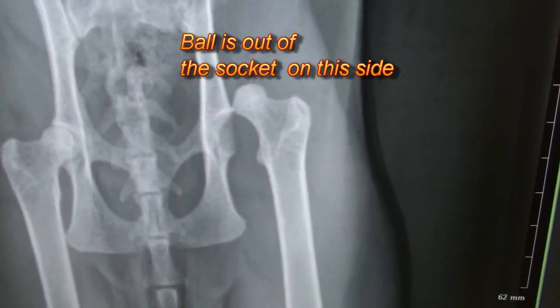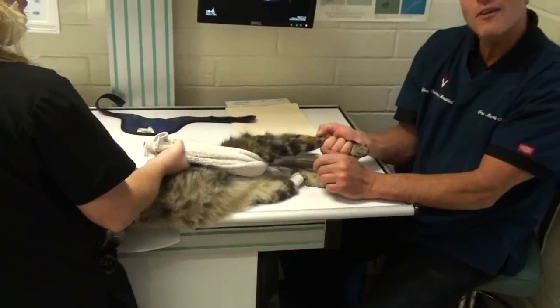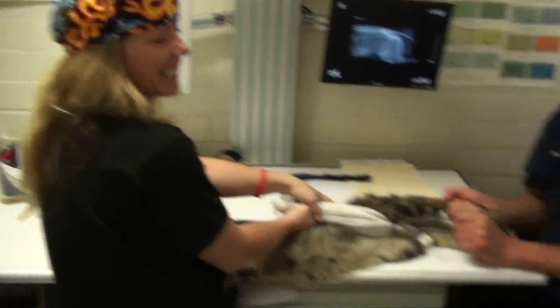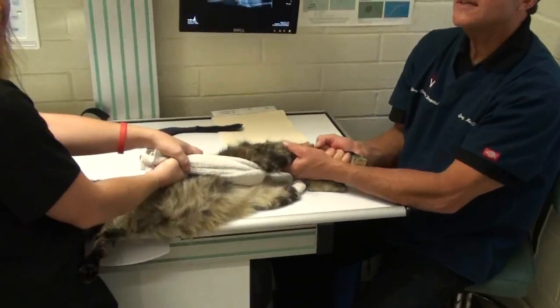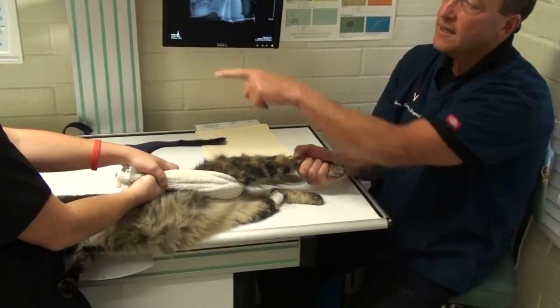So we're going to put it in. Desiree — that's better — Desiree's holding this kitty in a sling so that the muscles can get fatigued.